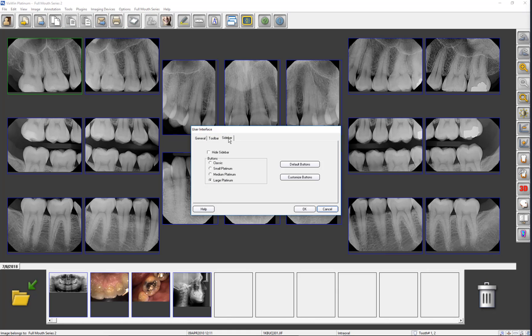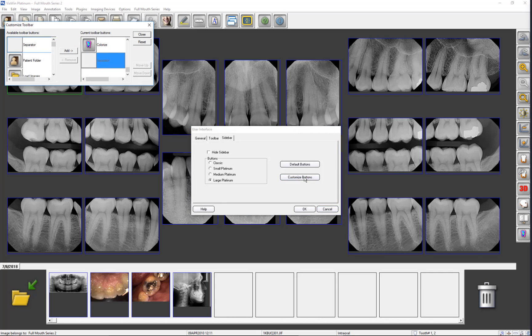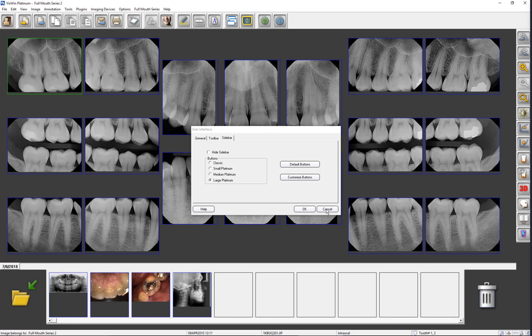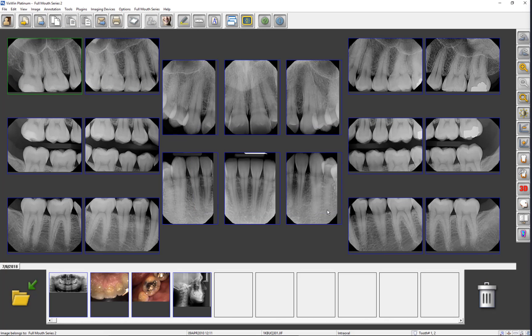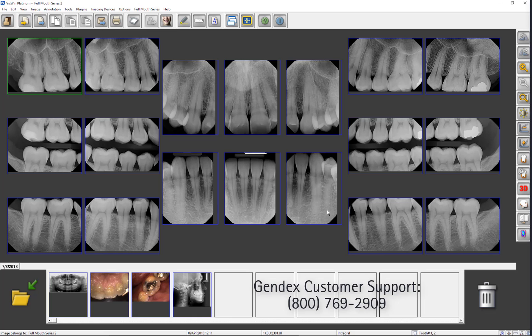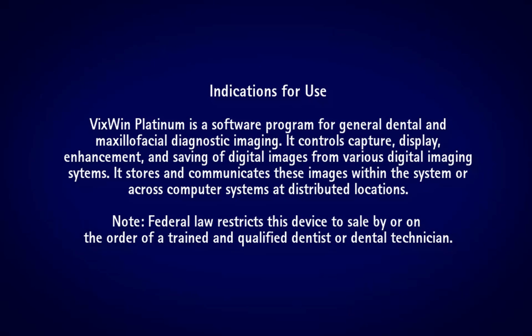This completes an overview of the User Interface. If you have any unanswered questions or if you would like additional information, consult the VixWin Platinum 3.5 User Manual, which can be accessed by clicking the Question Mark Toolbar button. If you still have questions, contact Gendex Customer Support at 800-769-2909. Thank you.